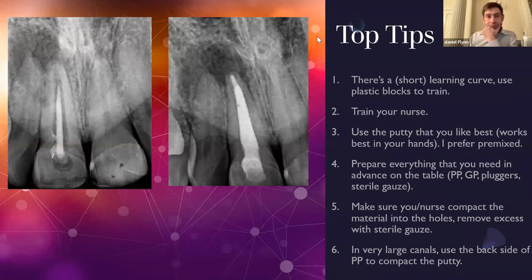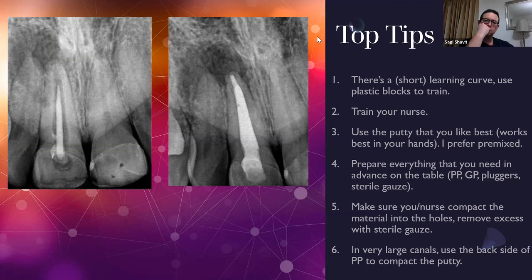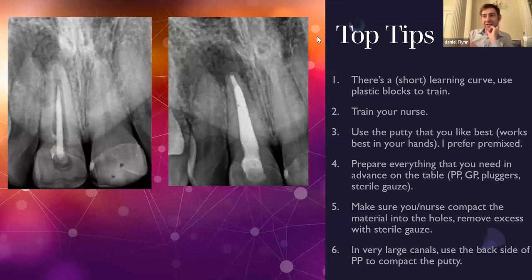Yeah, absolutely. We have these flexible plastic tips now that can be quite good for that as well, because they're size 30 and they're flexible, but they're also rigid. They're much more rigid than GP, so it's easier to place apical plugs with those, and they cost like £2, and they're autoclavable as well. It's a really nice, easy way. And you can attach them onto your ultrasonic unit, so they're actually quite easy to use, almost easier than a hand plugger or two.